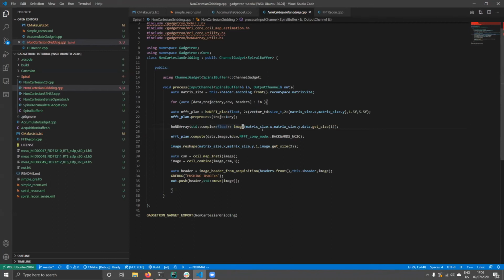We make an image, essentially a place to store the output, and we call compute. It takes the data, the image, the density compensation weights, and we tell it what sort of NFFT we want. We want a backwards, so an inverse NFFT, and we want it non-Cartesian to Cartesian. So that's the basic image reconstruction. We reshape the image and add this 1 dimension so it's in the format of the ISMRMRD, which wants X, Y, Z, channels. Then we can do the coil map, the coil combine, and the image header exactly as before.